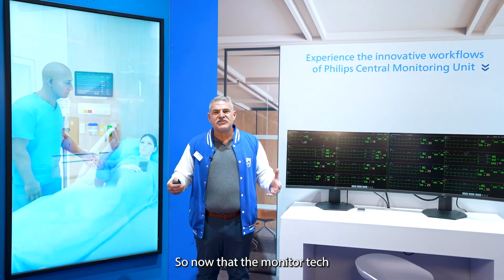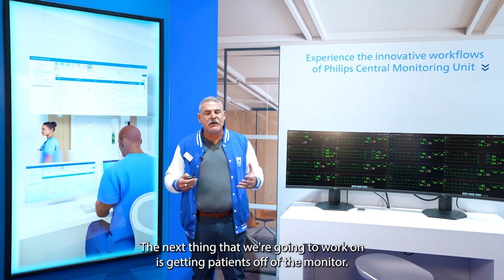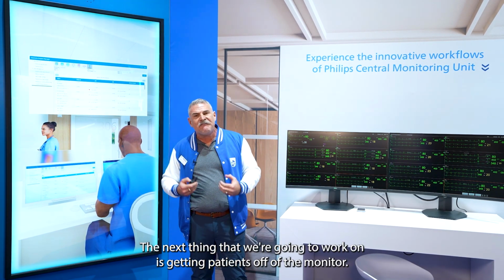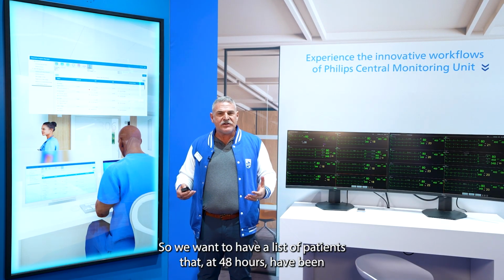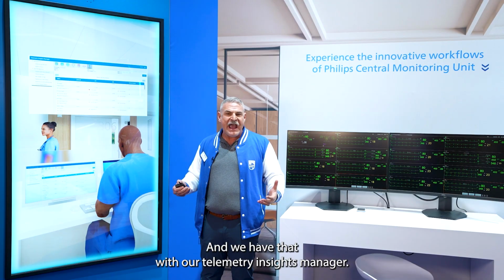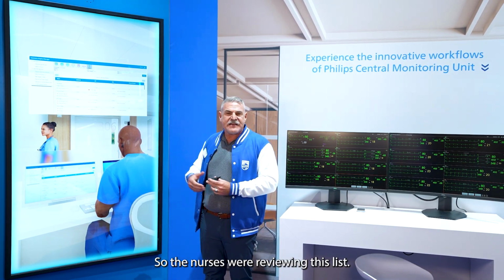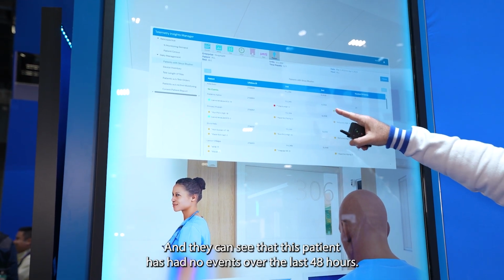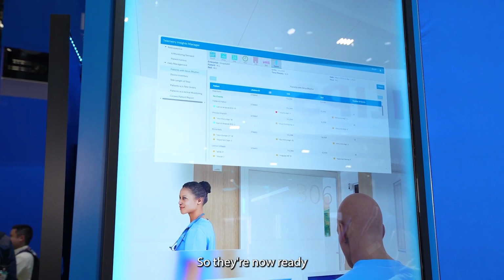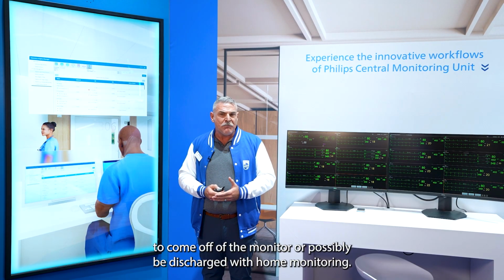So now that the monitor tech has been able to see that somebody is taking care of the alarm, the next thing that we're going to work on is getting patients off of the monitor. So we want to have a list of patients that at 48 hours have been arrhythmia free. And we have that with our telemetry insights manager. So the nurse is reviewing this list and they can see that this patient has had no events over the last 48 hours. So they're now ready to come off of the monitor or possibly be discharged with home monitoring.